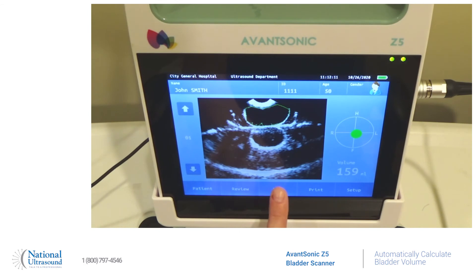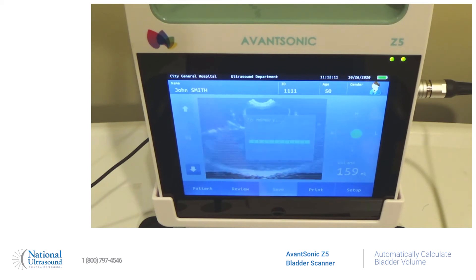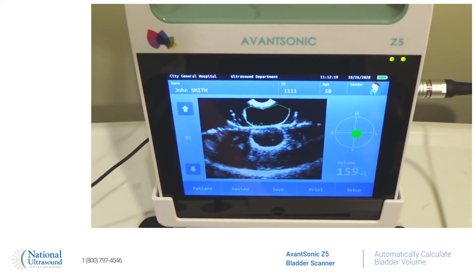You're going to save that. It's all stored, and it will also save about 10 or 12 images from the sweep. All of those images will be saved along with your bladder calculation.